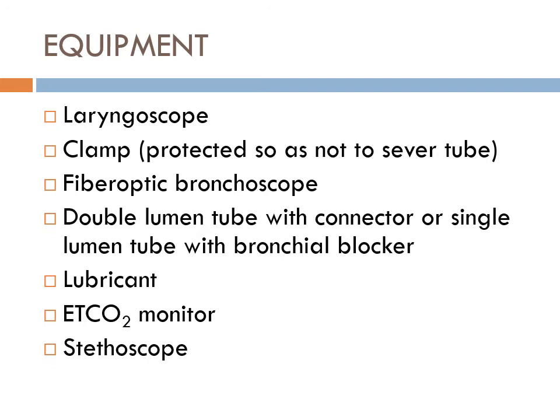It doesn't matter which side the yellow goes or the blue goes. What you're looking for is for this to go in and hug the carina. Then you notice with the fiber optic scope, looking down from above, I don't care which side goes where. I need to know which side is the side that I need to include. So in this case, the yellow goes right here, and let's say the blue goes here.